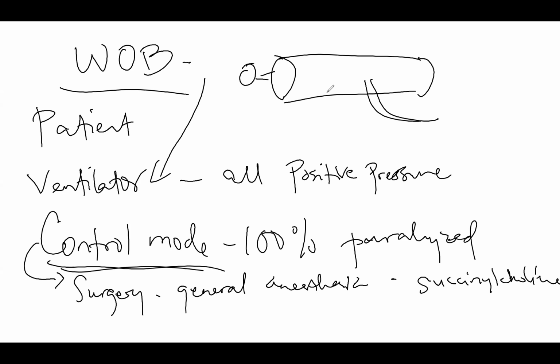It wasn't conducive to caring for the patient, because each time we need to turn or assess the patient's lung sounds or check their skin or do any other assessments, we have to interrupt the therapy. We have to take them out of the cylinder and then do whatever we need to do. So you can understand why they didn't last long.